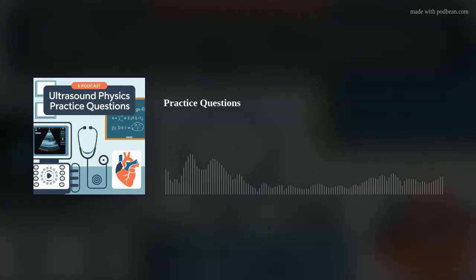Exactly. And here's a key thing for you since you're prepping for this exam. Axial resolution is usually better in ultrasound than lateral resolution. That's because axial resolution comes from the length of the sound pulse, and those pulses are super short. Lateral resolution, though, comes from the width of the ultrasound beam, and that's usually wider than the pulse length. Think about it like a flashlight. A narrow beam of light gives you a nice, sharp spot.